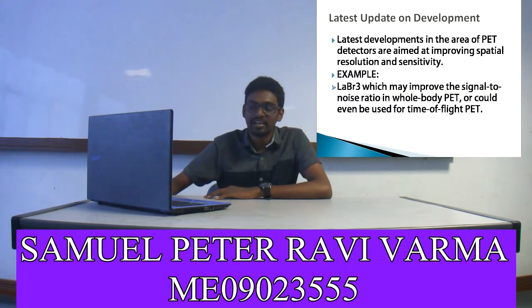Very good morning. My name is Samuel, and I'll be explaining the latest update on development of PET. The latest development in the area of PET detectors aimed at improving spatial resolution and sensitivity, such as LaBr3, which may improve the signal to noise ratio in whole body PET, or could even be used for time of flight PET.